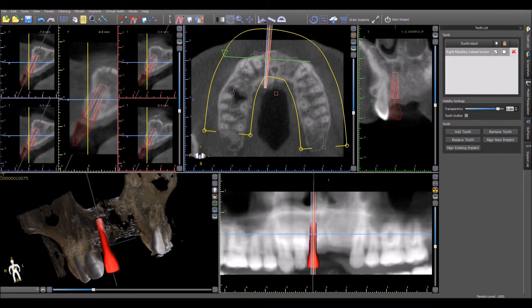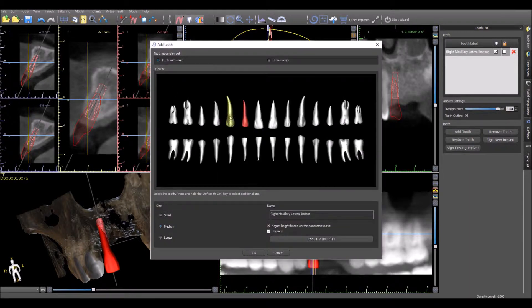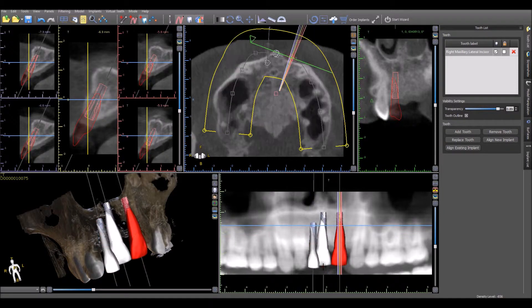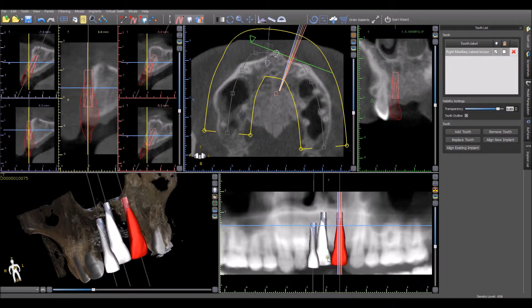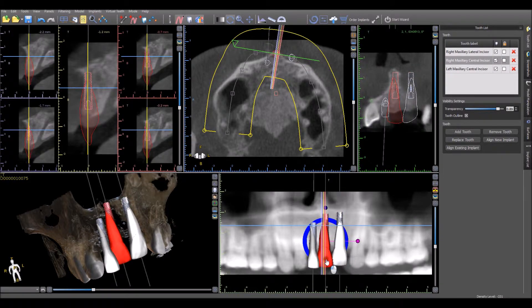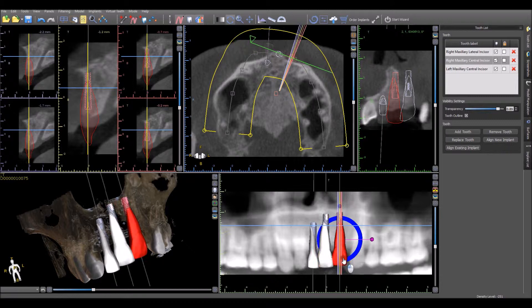To place multiple virtual teeth and multiple implants at the same time, select Add Implant. Click on the first tooth you would like to place, then hold down the Shift key and click on the second and any additional teeth you would like to add. Press OK and left click in the view where you would like to place the first tooth selected. The teeth and implants are now added to the views and each tooth and implant combination can be moved and manipulated separately.